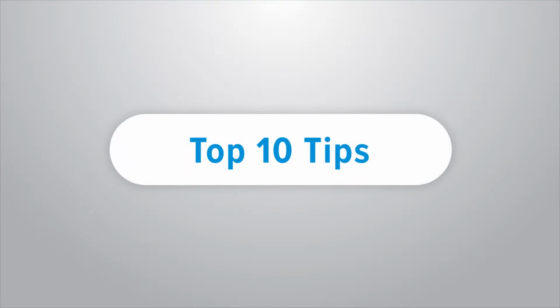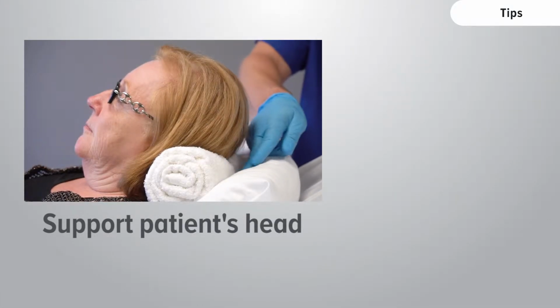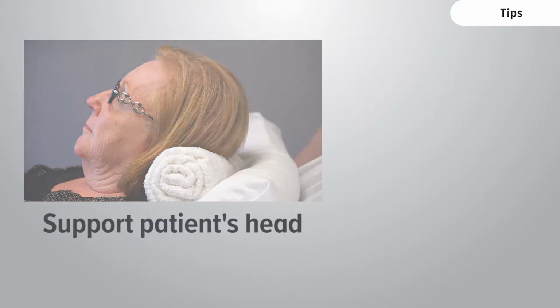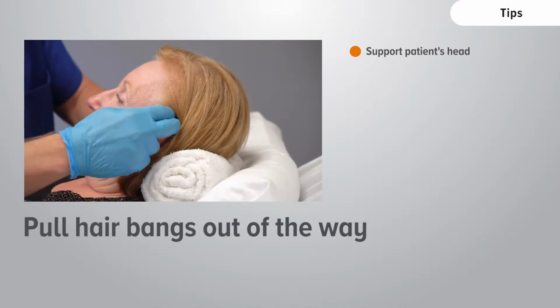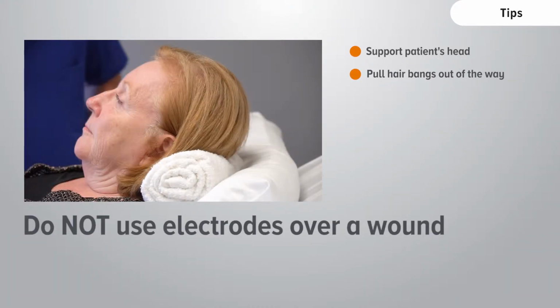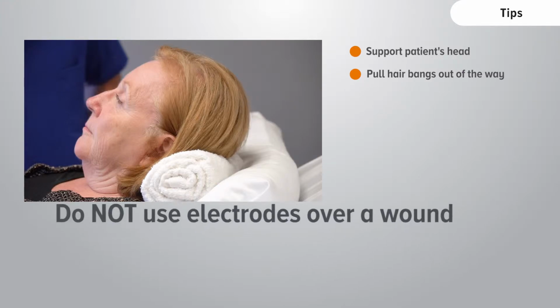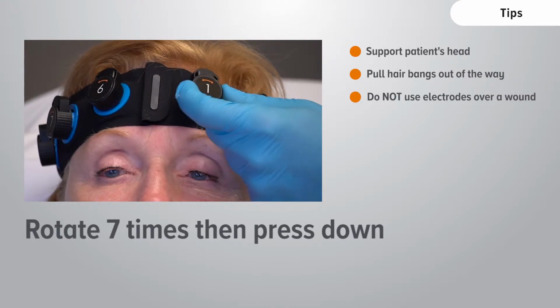Finally, remember these top 10 tips. Always support the patient's head to minimize pressure from the electrodes. Pull hair bangs out of the way of the electrodes. Assess wounds on the head. Do not prepare any electrodes that are over a wound. Rotate electrodes 7 times, then press down.